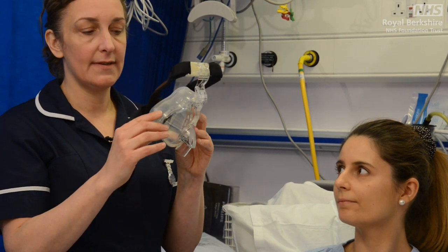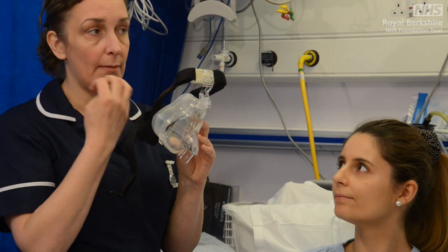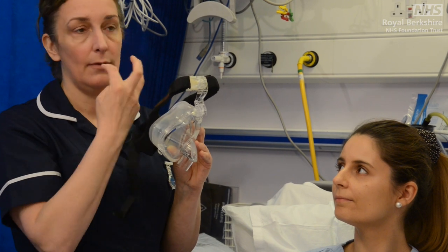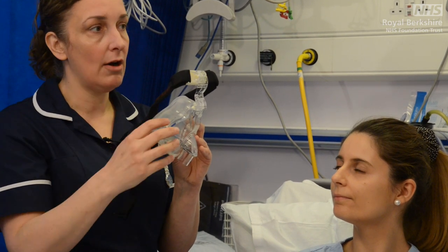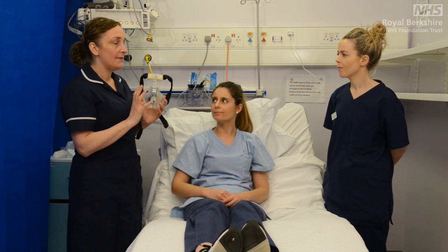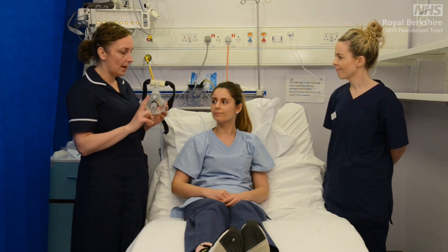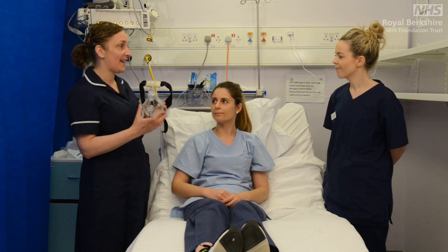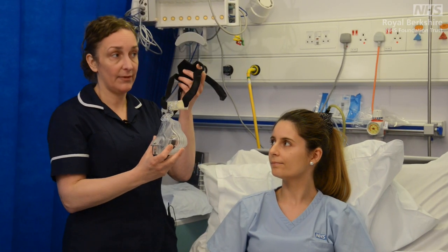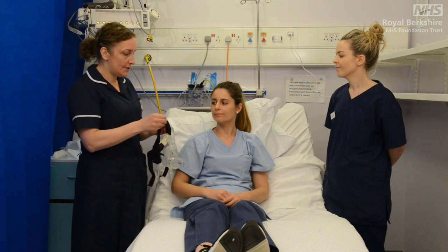Likewise, if the mask is tilted in the other direction, you're going to end up with a lot more pressure on that part of the patient's face. Mask fitting ideally is a two-person technique, because you need somebody to hold the mask and then equally adjust the head straps for your patient. So first thing I tend to do, Kerry, is just loosen off your straps a little bit.